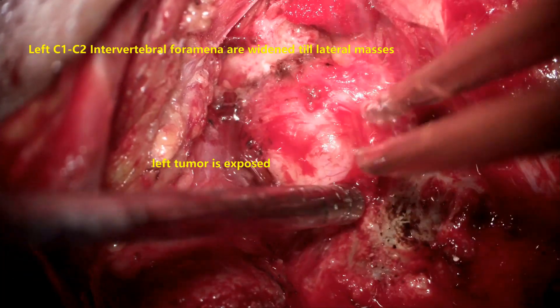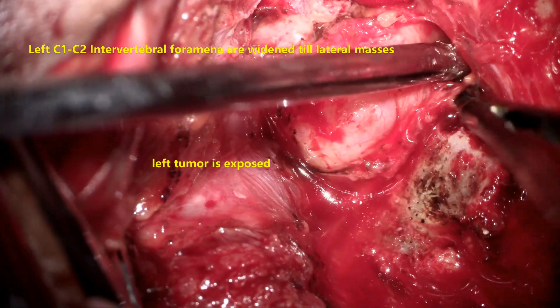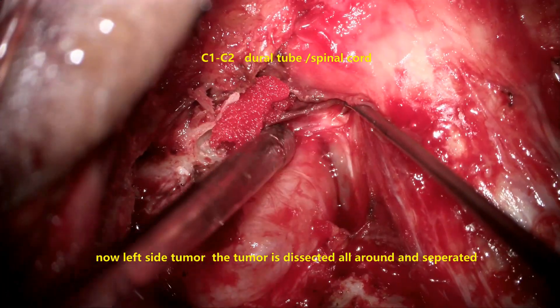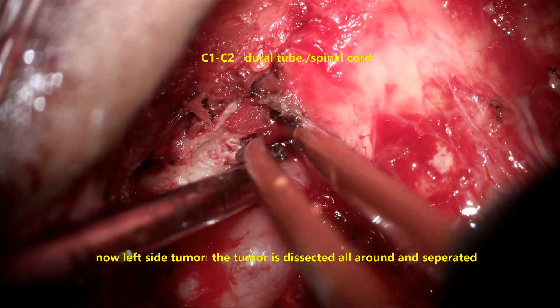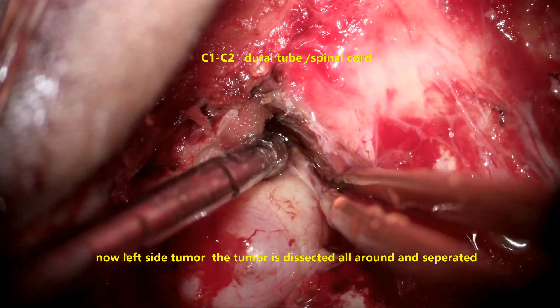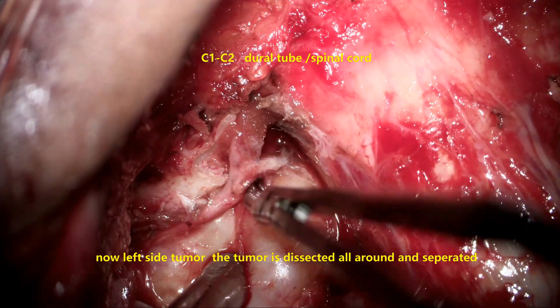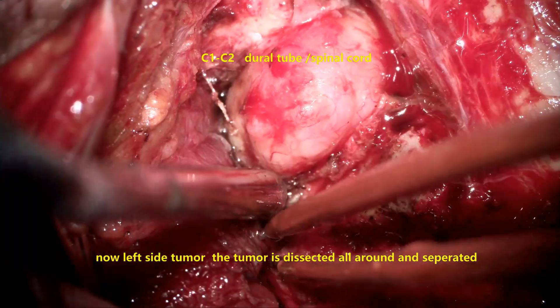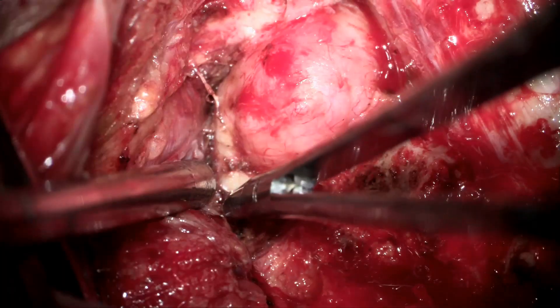Once that is done, dissection of the tumor is started. The fibrous covering of the tumor capsule or the root is exposed up to the dura. The tumor is situated in the C1-C2 space and is significantly pressing on the dura — that is the origin of the tumor from the C2 on the left side. The proximal part of the root is coagulated on the surface; blood vessels on the surface of the root are coagulated and devascularized. The fibrous tissue into the intervertebral foramen and C1-C2 space is released and the root along with the tumor is released.